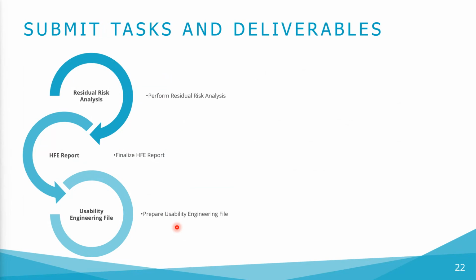Prepare usability engineering file to document compliance with IEC 62366. As another final step, we also need to prepare documents for our usability engineering file to comply with IEC 62366. Notably, most of the content developed per previous steps of this project plan and in the course of developing the HFE report for FDA or EU MDR can be leveraged to populate the usability engineering file.